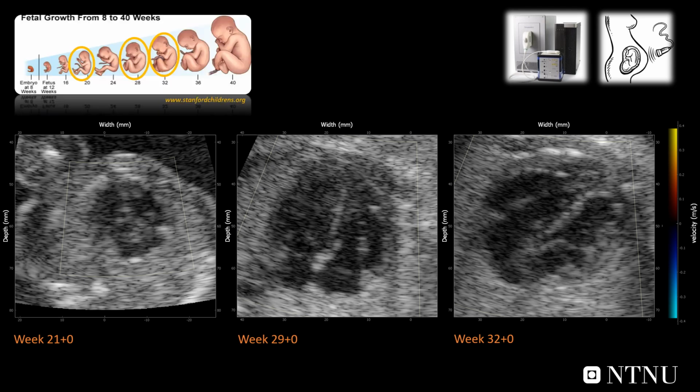We included 10 women with healthy pregnancies and did high frame rate recordings in approximately week 20, 28 and 32. Even though week 20 is approximately halfway through the pregnancy, the heart is tiny, only 1.5 to 2 centimeters long. Throughout the pregnancy, as the fetus is growing, we could see that the heart was getting bigger, but still at week 32 it's only 3 centimeters long.